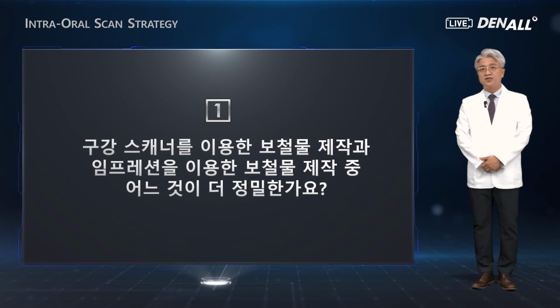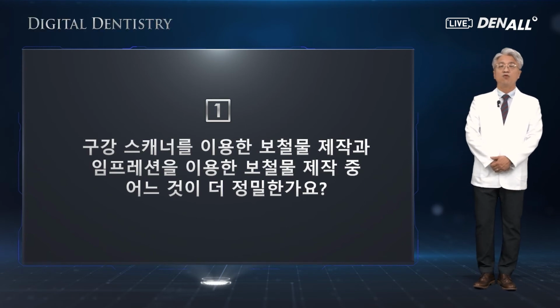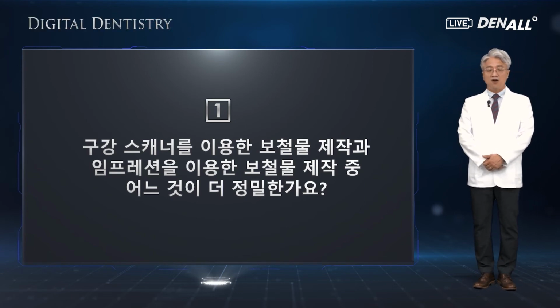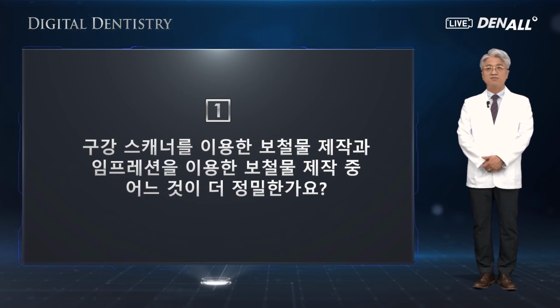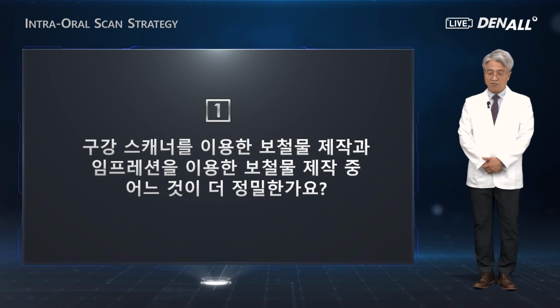The model is processed using an oral scanner and the conventional rubber impression taking. If you compare them, I cannot give you the only and definitive answer, but based on my clinical experience, the conclusion is the model processed with an oral scanner is far superior in precision, far more convenient. It's incomparable to the rubber impression taking. There are some reasons on my part.